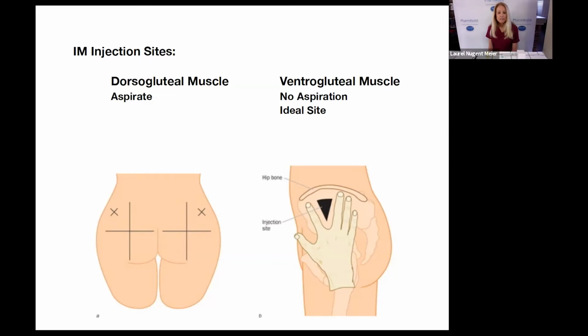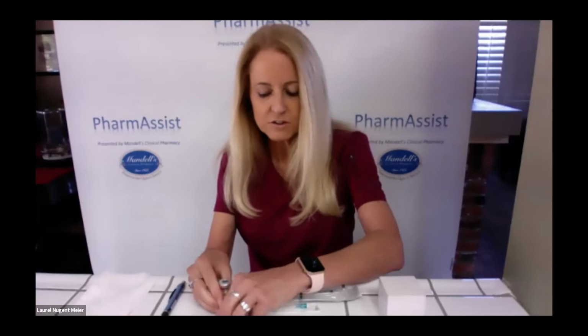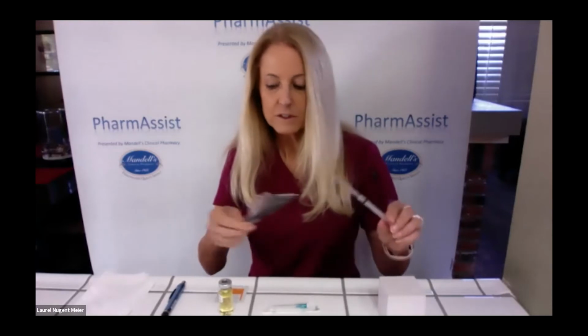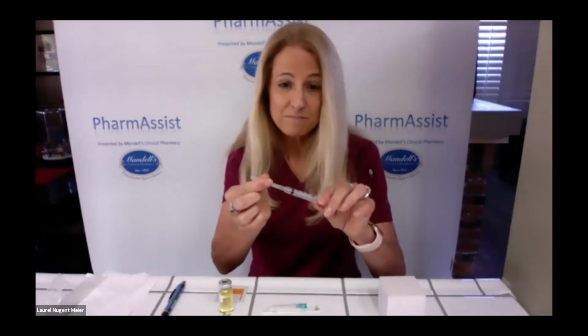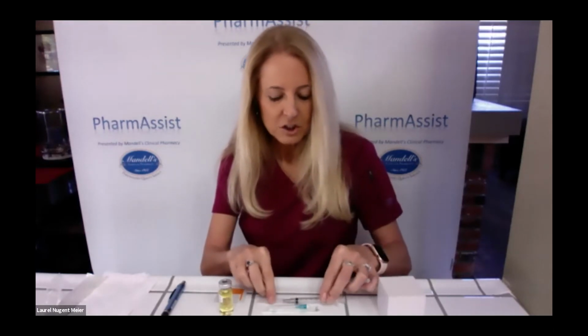So now I'm going to show you how to draw up the progesterone in oil and give it yourself. So the first thing you're going to do is collect all your supplies. You need a 3 ml syringe with a needle attached. When you take it out of the paper, you just need to make sure it's twisted on all the way. The reason why these are not twisted on all the way is because with the sterilization, they have to have them a little bit loose.